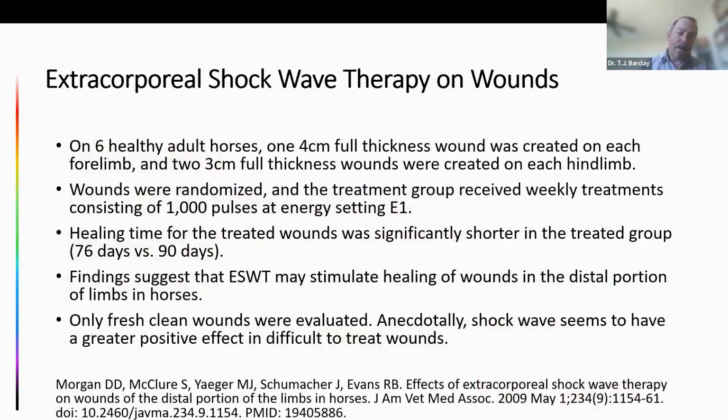And then, of course, this applies to horses as well, because as we all know, horses are really adept at sustaining large wounds in areas with poor blood supply. So, this was a study done by Dr. Scott McClure and his group.